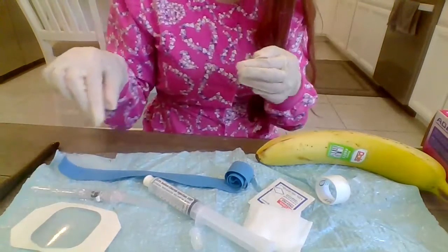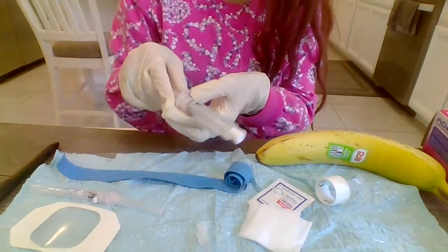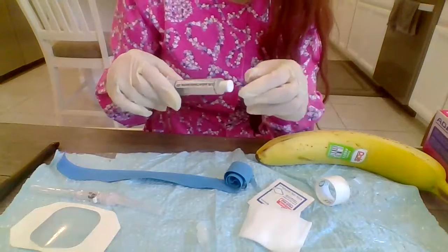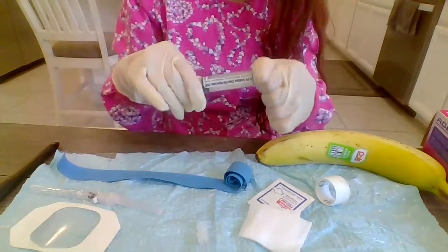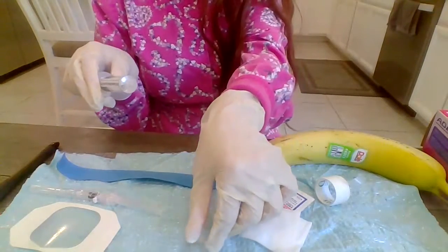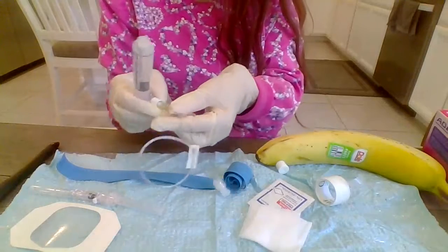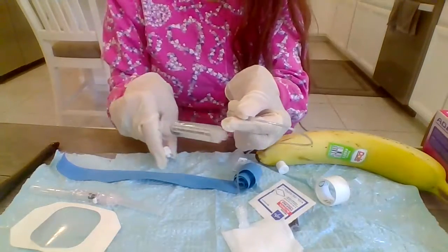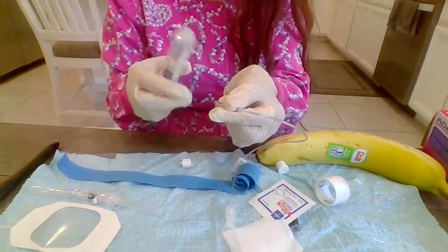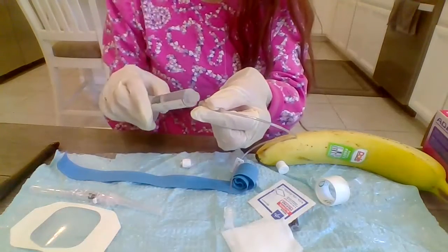Now I'm going to connect the saline flush to the extension kit. Let's see. I'm going to remove all the excess air.